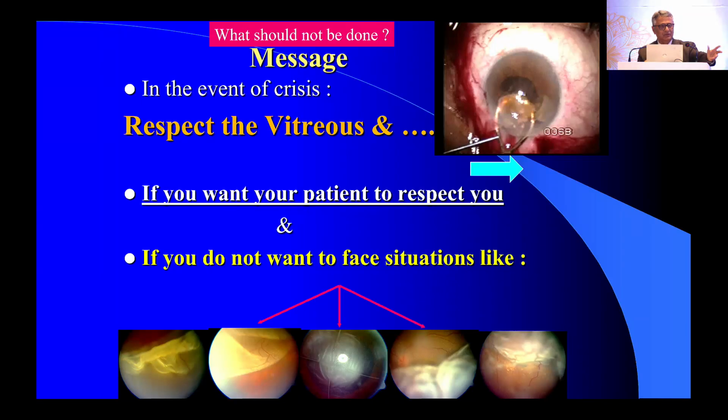He showed indirect, OCT, free OCT, you have to keep doing. Otherwise, believe me, things like this, a GRT, this is a detachment, this is a CME, media haze, this is PVR. There are more examples like this, but I thought I'll show you this is a reality. This is not a myth that I'm speaking from here, or Shell or Priya. You have to respect the vitreous.